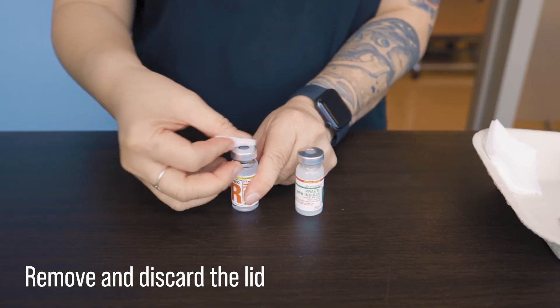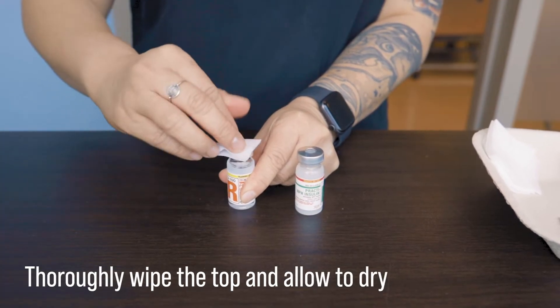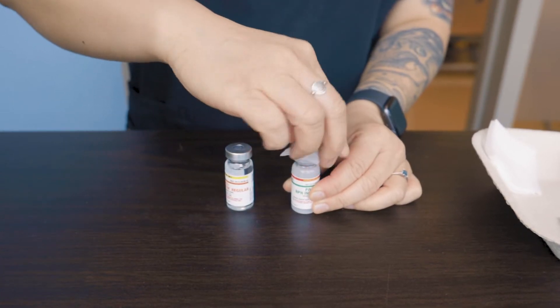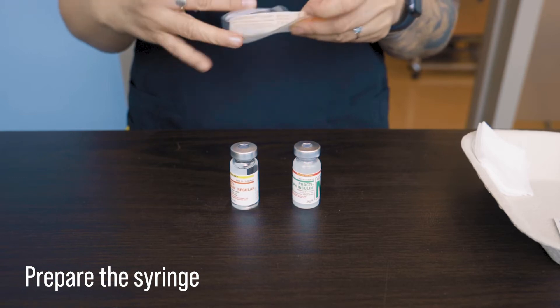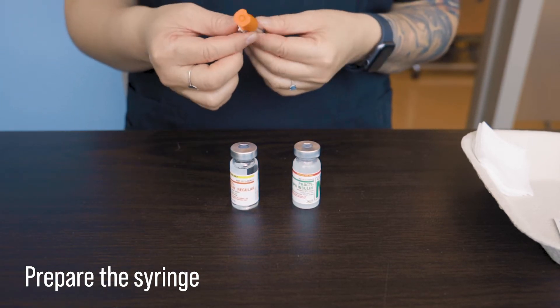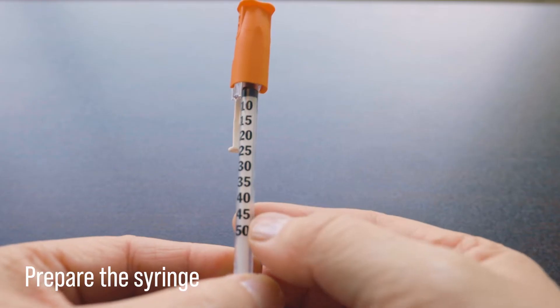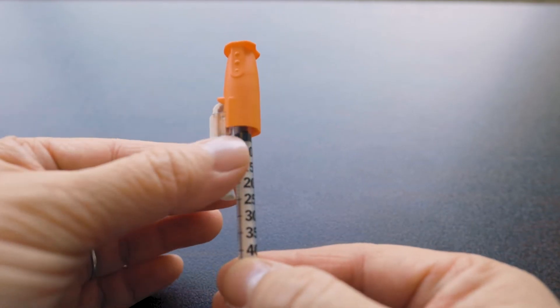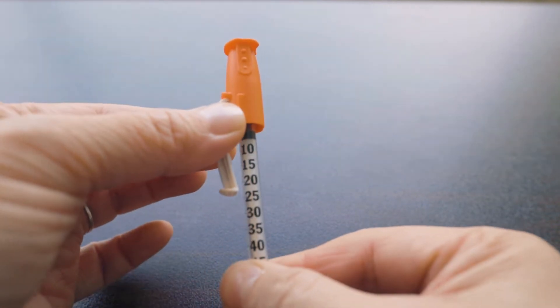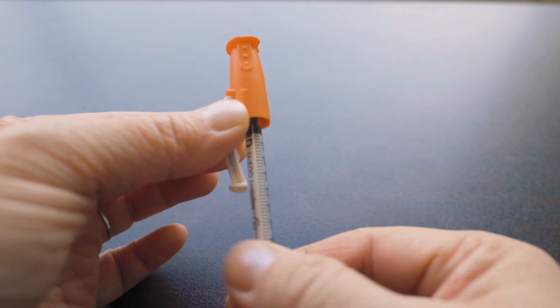We will remove and discard the lid if it is a brand new vial and wipe the top clean with an alcohol swab, then let dry. Then we want to prepare the syringe. Here we are using the low-dose insulin syringe, which is the half a milliliter. Make sure the package is intact to ensure its sterility. If your syringe has a safety glide and it gets in the way, you can always twist it to one side so that you can see the meniscus or the lines without it impeding your vision.